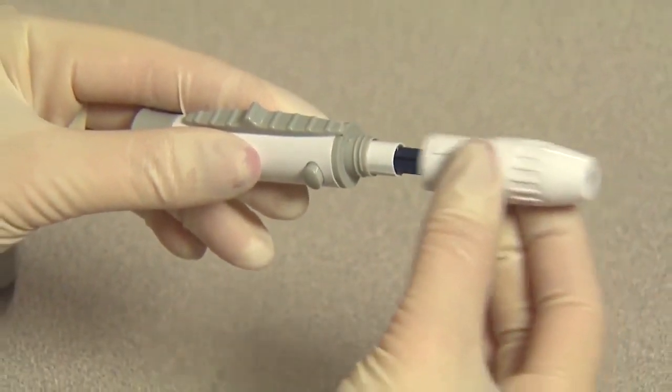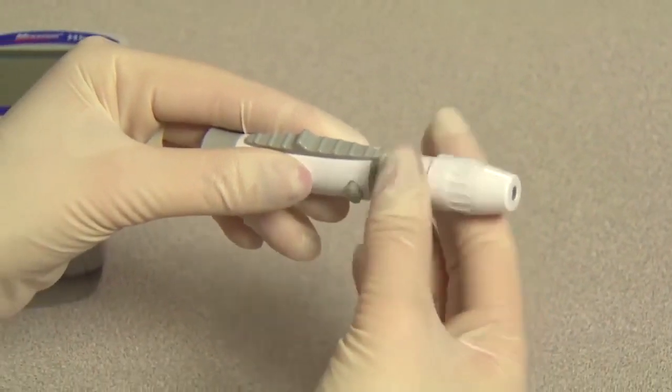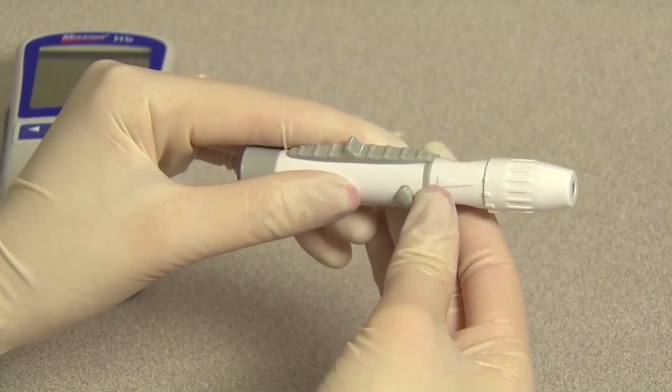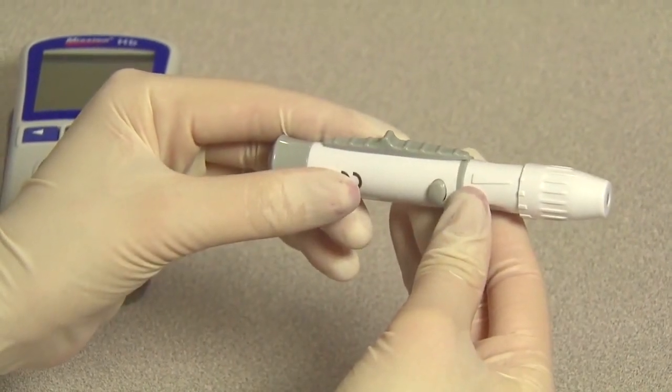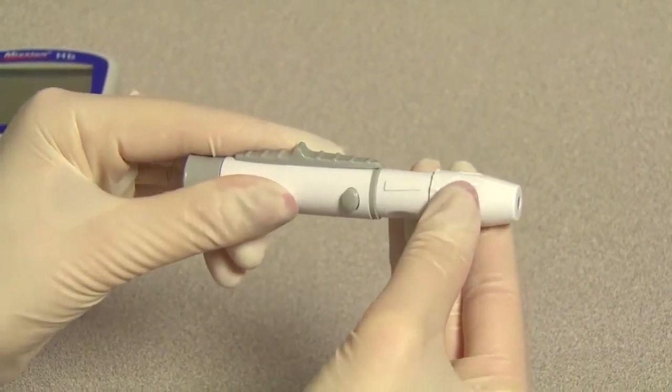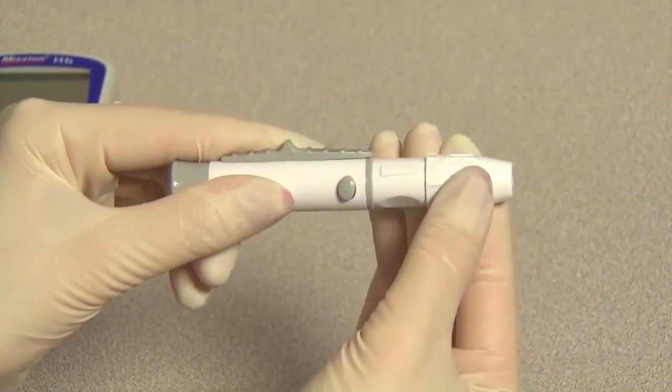Carefully screw the cover back onto the lancing device. Avoid contact with the exposed needle. Make sure the cover is fully seated on the lancing device. Adjust the puncture depth by rotating the lancing device cover. There are a total of 6 puncture depth settings.